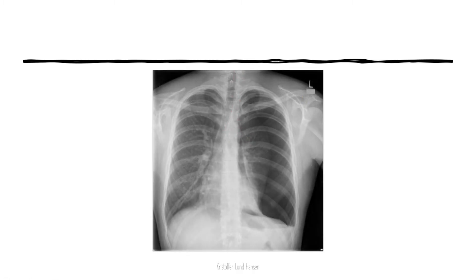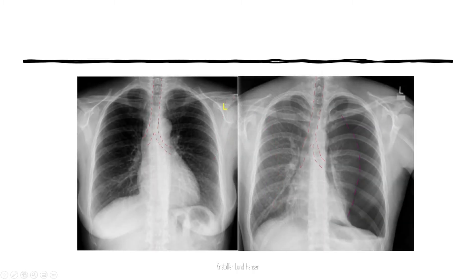If the trachea or bronchi is misplaced, try to see if you can find the cause. In this case, it is due to a pneumothorax that is pushing the lungs towards the right, which also pushes the trachea and bronchi more towards the right. Other causes of misplacement could be a mass, like a cancer in the mediastinum, pushing directly on the trachea. On the comparison image, you can clearly see the trachea is misplaced towards the right of the chest.